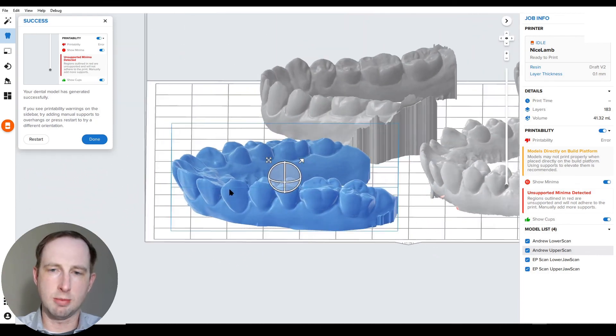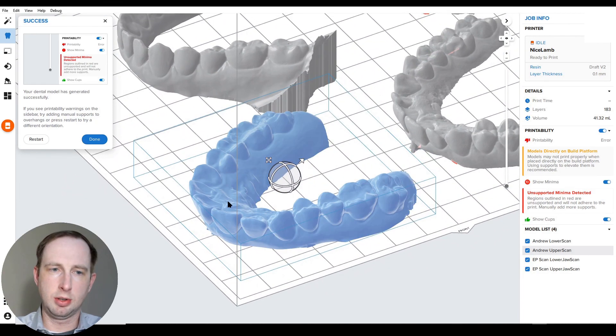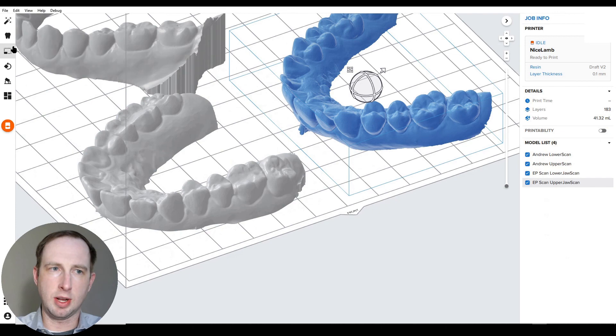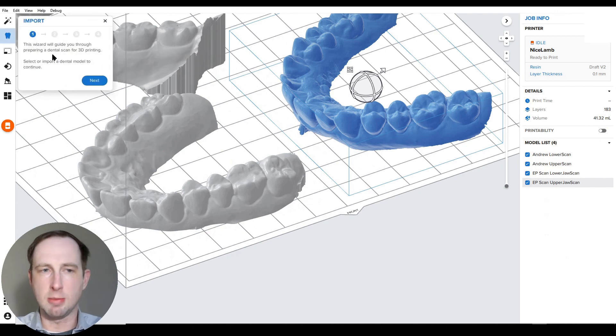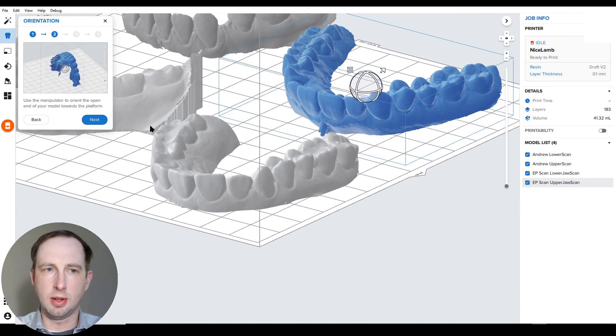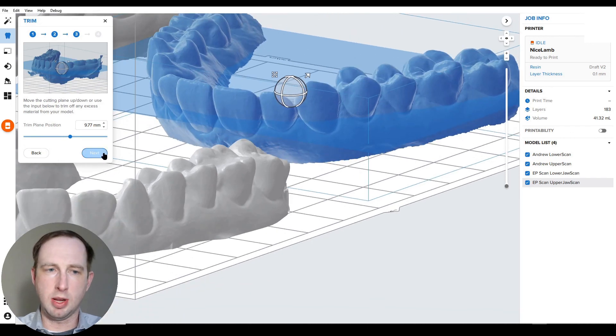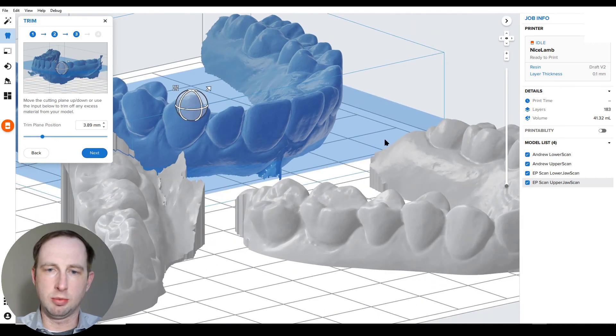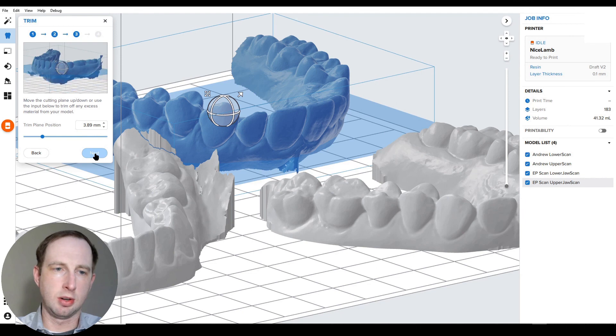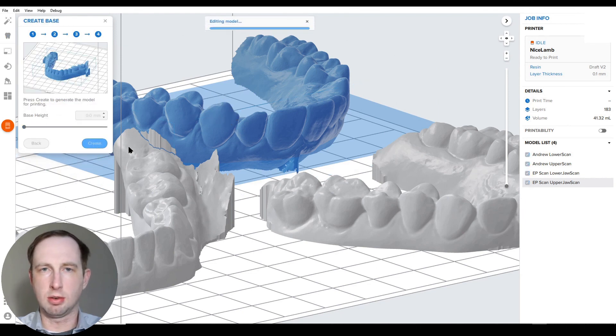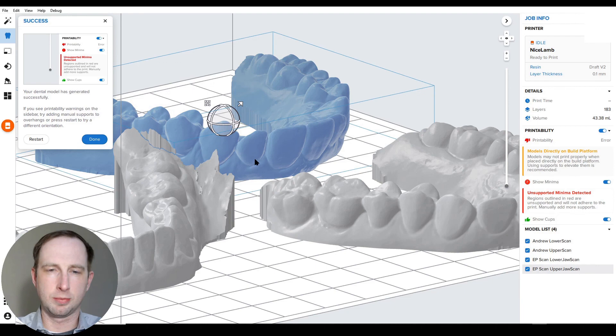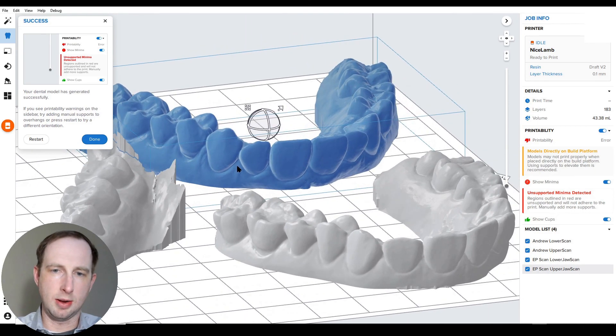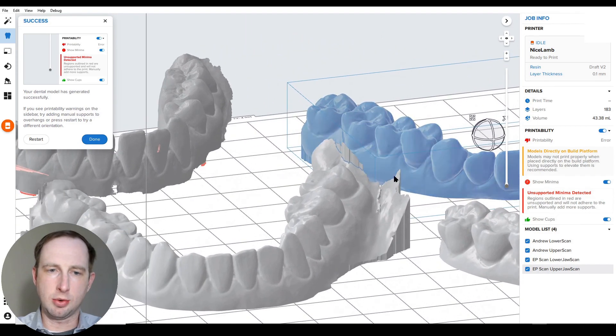Okay, now our second model was built, looking pretty good. I'm going to hit done, move on to the next, scan the model again. Again, orientation's good, keeps our cut plane, just quickly make a small adjustment there. We want to keep enough of the gingiva here. Next, no base height, create, moving on. Okay, third model's done here. We're ready to move on.